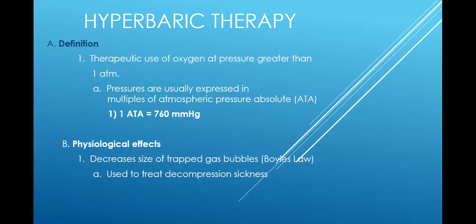So tomorrow we'll do hyperbaric chamber and oxygen cylinder, analyzers, right? Which measures the FiO2 of the gas. And that's going to be it, okay? We'll show you a few more things, because that's going to take probably most of the day, because it's a lot of information. But other than that, it will be up to you to look at the videos that are available for you in the module, do the reading and the lectures, and you should be able to hook this stuff up by just putting it on the table, and you grab what you need. If you look at it and study it, you'll be able to do it with no problem.